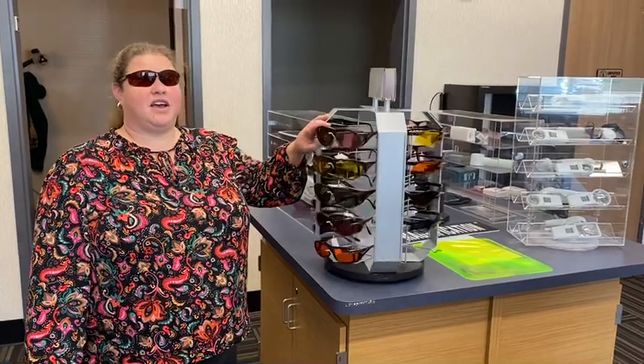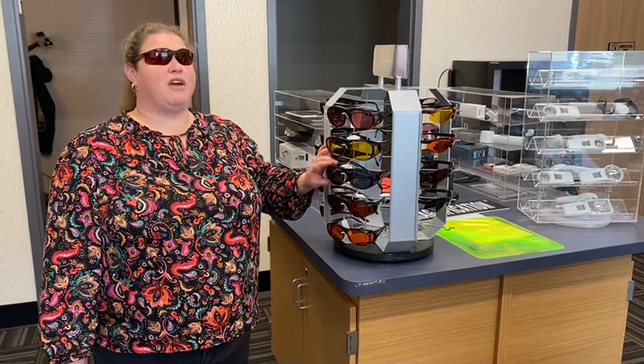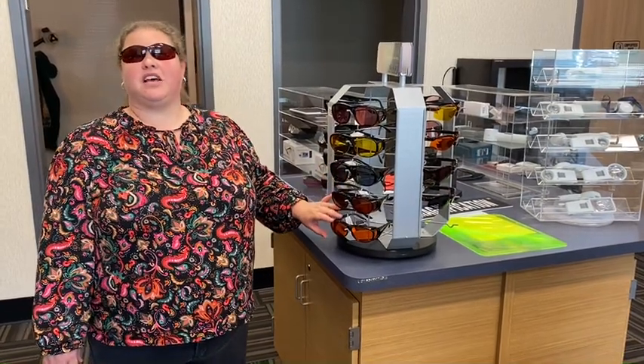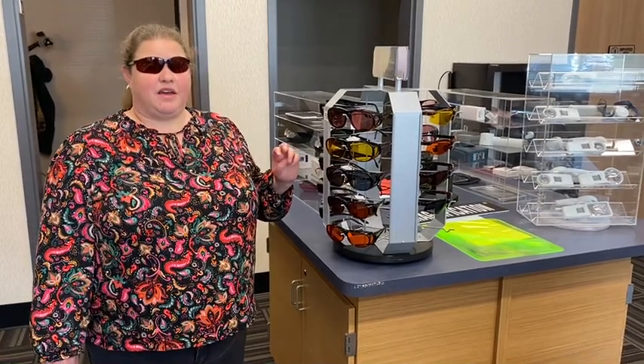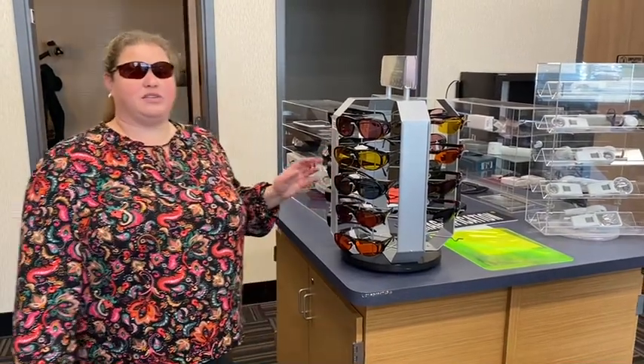Our next kind is one that you can wear without glasses or with. The medium size fits better without and the large size may better fit your glasses depending on the type you have. These come in similar colors and have the ability to be polarized or not polarized depending on which kind you buy.